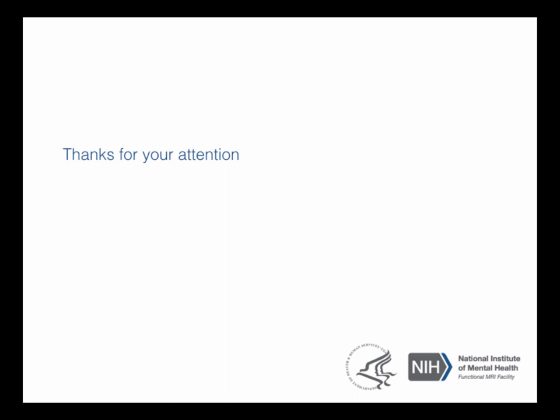Hitherto, doing SMS required you to pretty much write your own sequence or go to one of your colleagues at another site who've already done it and bring it in. And the tough step wasn't so much writing the sequence; it was getting the reconstruction to work right. It's quite a lot of effort to make it work well.